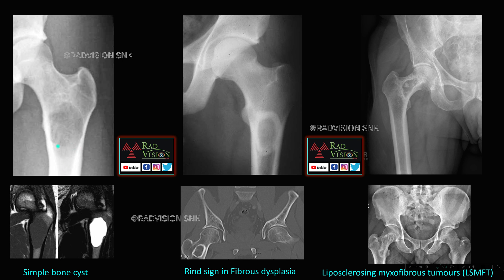Next is a similar picture involving the proximal femur, especially the shaft. Here you can see a well-defined radiolucent expansile lesion with no significant sclerotic rim. This was a simple bone cyst, which appears hypointense on T1 and hyperintense on T2.